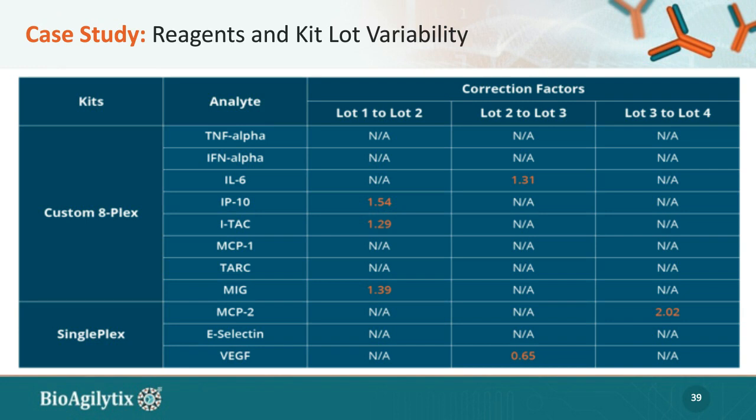The short of it is, we saw in some instances these biomarkers were holding ground pretty nicely, no change within 3 years in 4 different lots. But in some cases, you can see we almost see a 200% change, a twofold change, in just the variability from these kits. What does that mean? Let me maybe show you an example here.